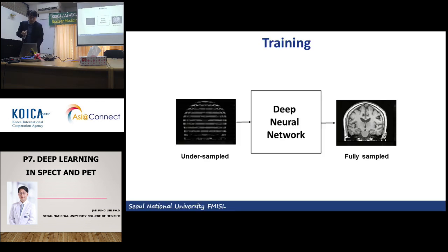In particular, we have had much interest in generating 3D MR from the 2D MR. If we have 3D MRI without gaps between the transaxial slices, we can apply many very advanced volumetric image techniques, like voxel-based morphometry, or we can calculate the cortical thickness of the brain using very advanced image analysis techniques.